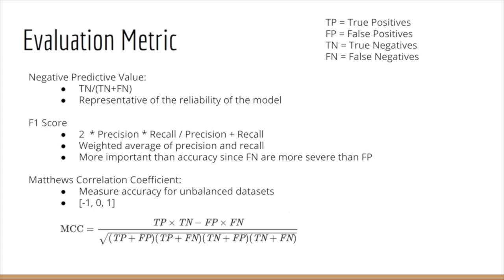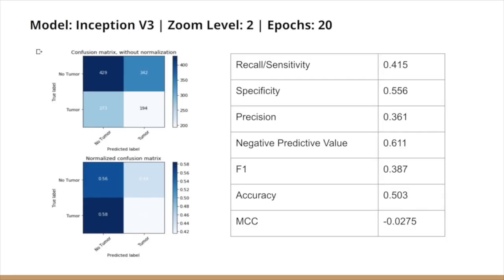The last metric we will compute is the Matthews correlation coefficient, which is best used for imbalanced data sets. It penalizes wrong classifications in both classes according to different weights. The metric ranges from -1 to 1, where 0 represents no better than random classification, 1 represents perfect classification, and -1 represents total disagreement. We trained 3 models using our dataset.